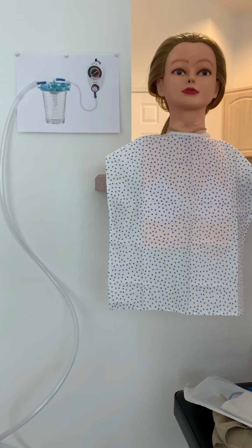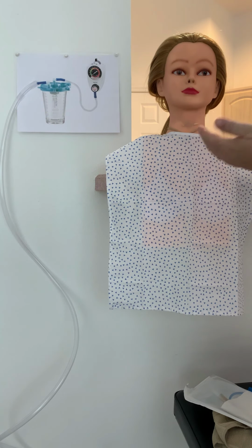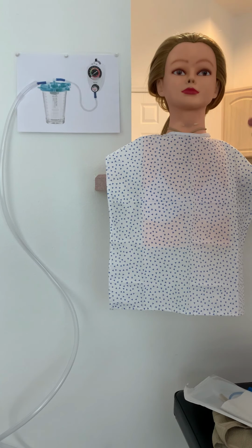So first thing we're going to do is wash our hands. And then we're going to knock on the patient's door. Hi, this is Linda, your nurse. I am just coming in to check on you. And it looks like your doctor has written an order for an NG tube to be placed. So the NG tube is just a tube that will slide down your nose. It goes down into your stomach.